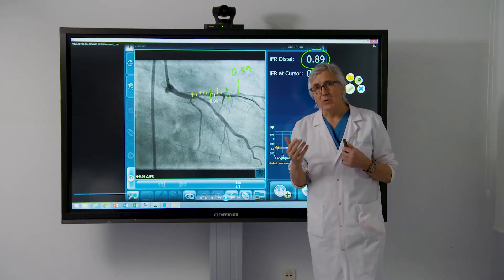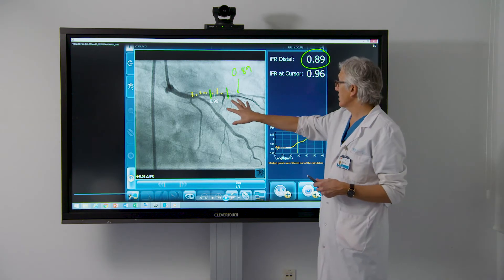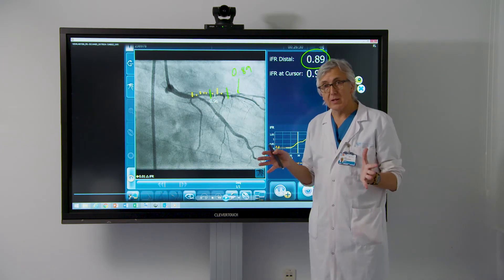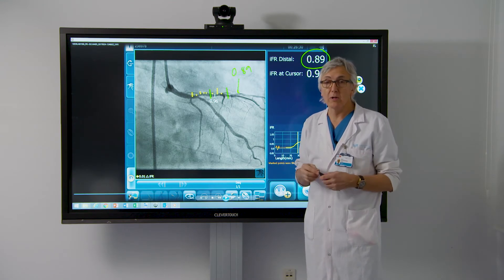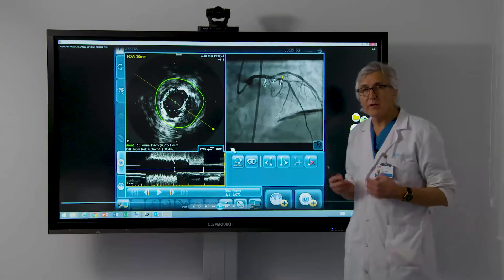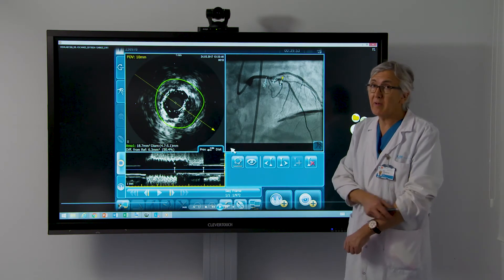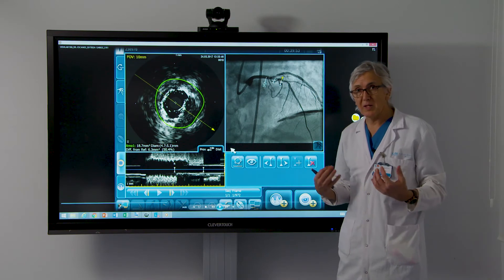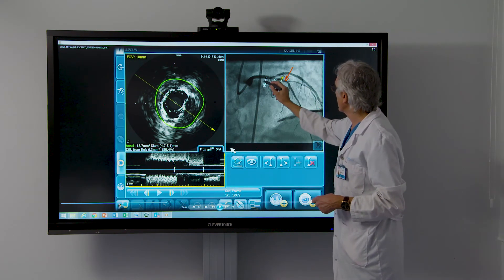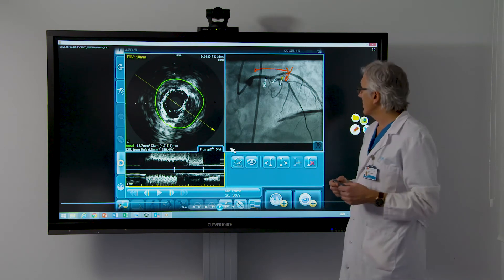Imaging is extremely useful now that we have the physiological information, helping us understand where to land the stents and how to achieve the largest possible stent and lumen dimensions for the best long-term outcome. One problem with IVUS in vessels with diffuse disease and calcification is that it may be very difficult to advance the probe to obtain pre-PCI images — which is exactly what happened in this case. We were able to reach only a certain level of interrogation, but we still obtained a great deal of useful information.